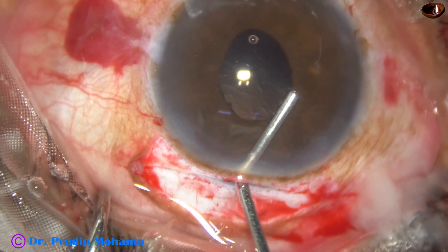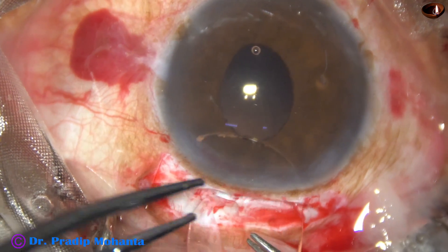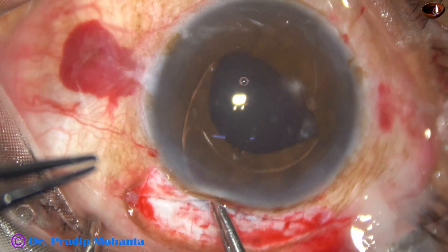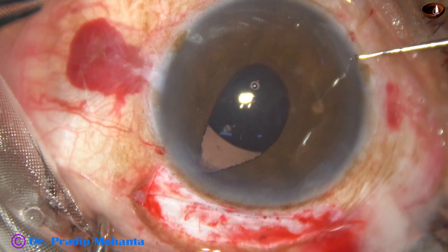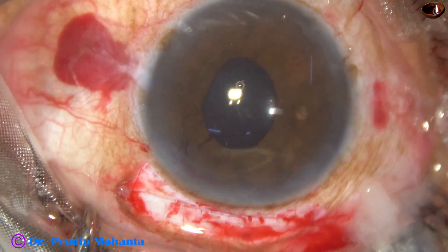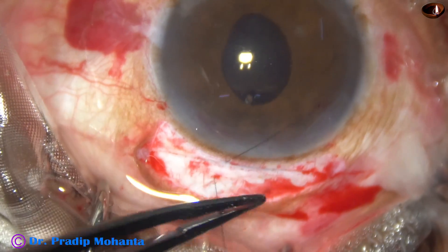I inject visco — 2% hydroxypropyl methyl cellulose — and implant a PMMA polymethylmethacrylate 6 mm optic intraocular lens. This is the Liberty lens from Appasamy Associates; I have no financial interest in the product. The lens is placed just under the iris — I do not worry whether it goes in the bag or in the sulcus, wherever it goes is fine. If the optic covers the pupillary area and the patient gets reasonably good vision, the patient is happy. A little bit of decentration will not cause much harm.